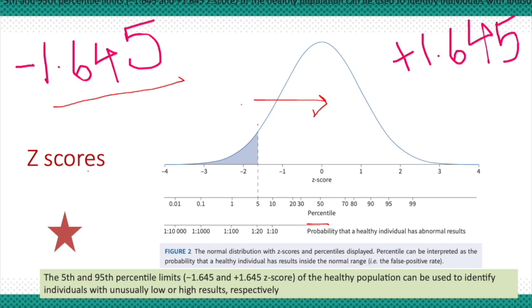So the use of lower limit of normal, or the 5th percentile, or the Z-score would be a better cutoff to define results which are abnormal, as compared to the fixed cutoffs as in the 2005 statement.